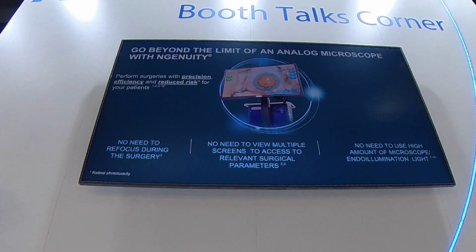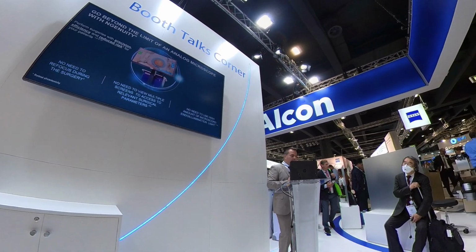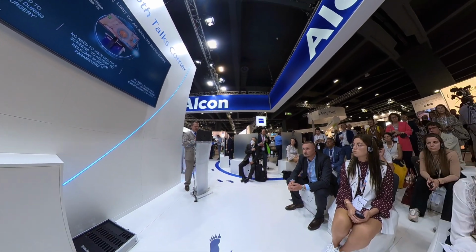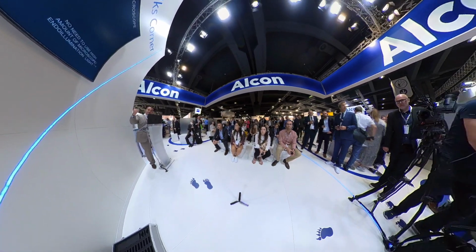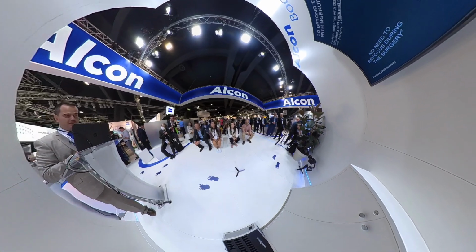So we can go beyond the limit, of course, of the analog microscope, because, for example, I'm presbyopic and I don't need to refocus during the surgery, and the image on the screen is actually my far vision. So it's important for the presbyopes, trust me.